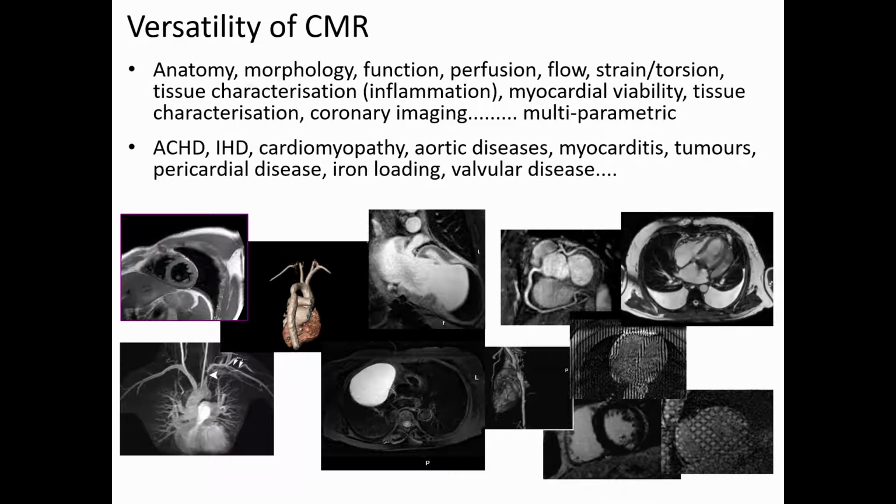And so if you like, in some ways, you could say we could combine all of the different techniques from CT, nuclear, echo into one scan. Controversial perhaps, but what you see is that really there isn't a cardiovascular disease area now in terms of pathology that, in some cases, you couldn't argue that an MR can be helpful to guide clinical management. Now, I'm not saying that we should be doing MR in everybody, because that's completely bonkers, but there are difficult cases, particularly when surgical decisions are being made, when all of these different cardiovascular disease conditions that you can see listed there, MR could be useful in that decision-making process.